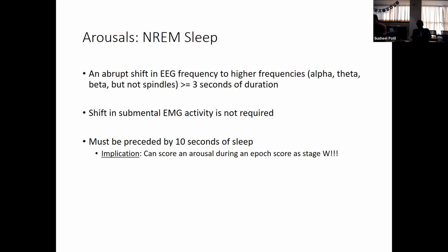And that's something a lot of people won't do, and that is very ripe for a boards question at some point. So you have the majority of the epoch being wake, and you call that wake, but there are 10 seconds of little sleep snippets and then an arousal. I got it. Exactly.